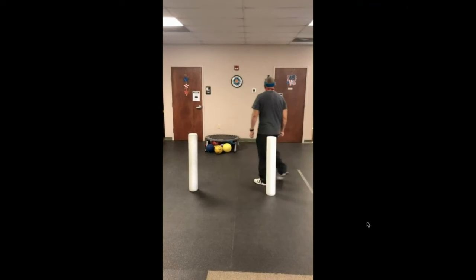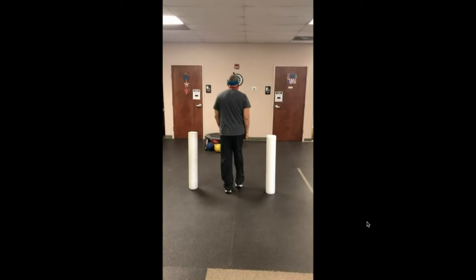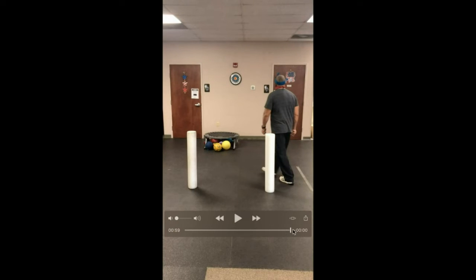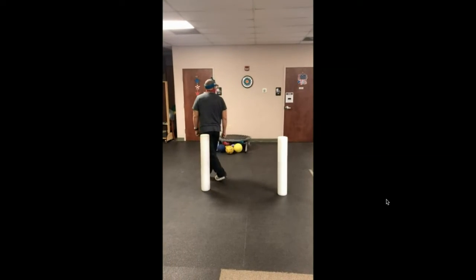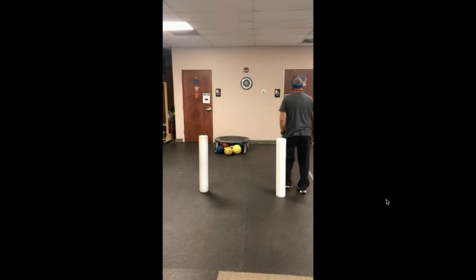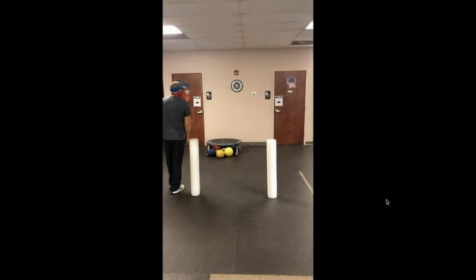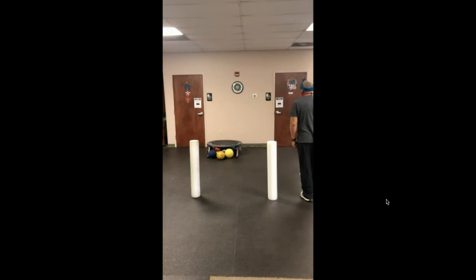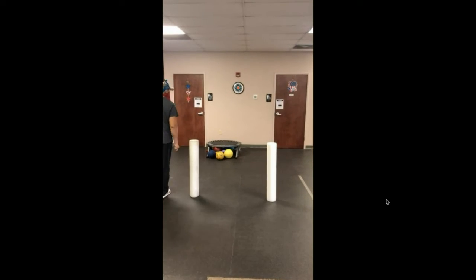But if you notice, he has a certain side and a certain rotation, either visually or from the neck, that he doesn't like to move toward as comfortably. So let's go back over this video and take a look here. Okay, so we could break this down in real time. So he's moving to the left there, which is right rotation as he comes back over. It's going to be left cervical rotation as he moves through. And he also has a narrowed excursion on the left compared to the foam roller. And he gets over and he's a little wider on this one. You can see him shuffling there to come back. So he doesn't look as comfortable over on that right side.